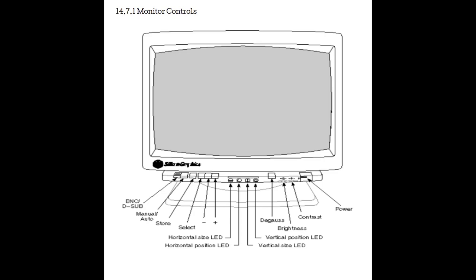Contrast is going to, again, determine how many grays are displayed on your monitor, and brightness is going to determine how light or brilliant the grays in the image are going to look. So I just have an example here. Again, if you've ever looked at your computer or your TV screen, you usually can change a few things around on your brightness and your contrast on your image. But again, remember, anything you change for your monitor is not displayed on your images.